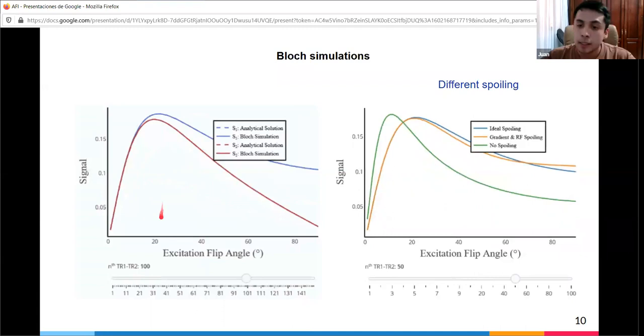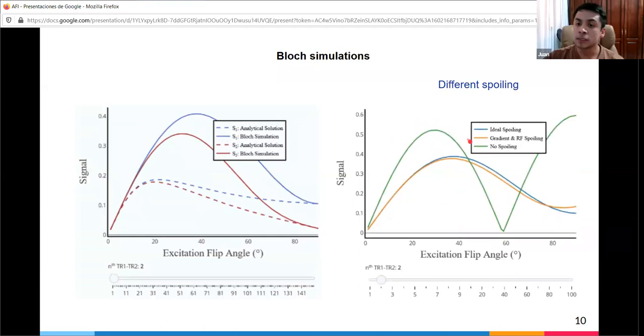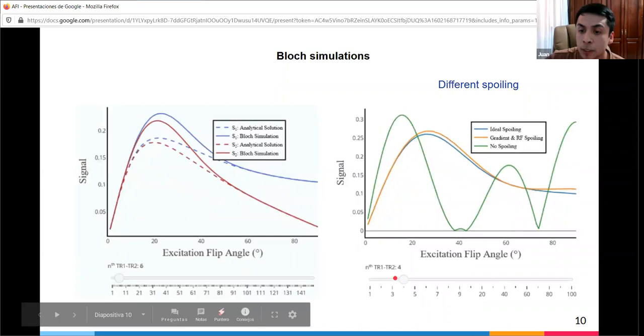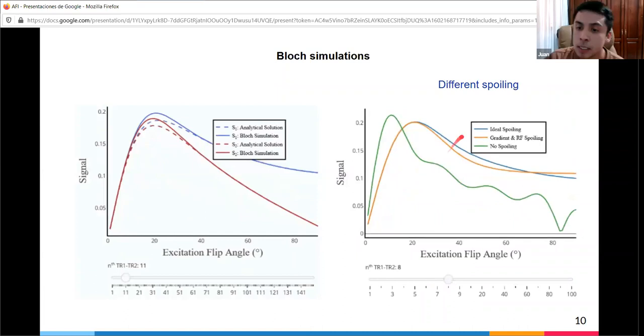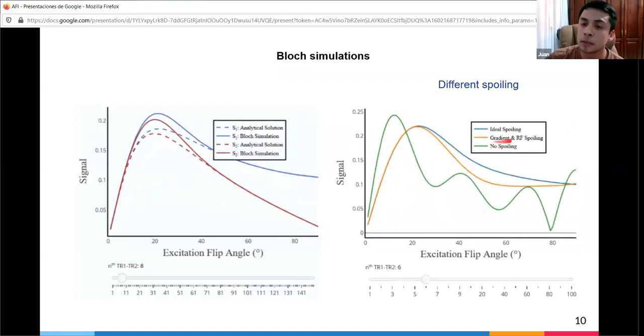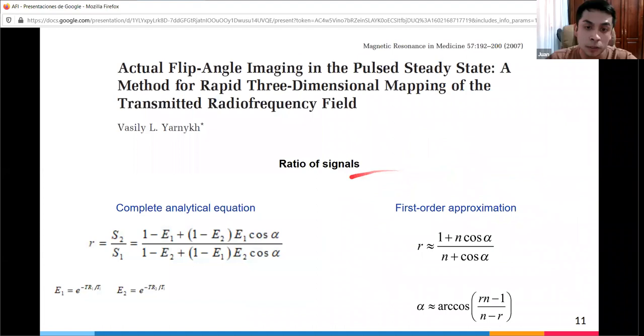Bloch simulations are useful to see the effect of different spoiling. The right curves correspond to signal 1 only. The blue line is the signal ideally spoiled, the green curve is signal with no spoiling. Between these two curves, even after many repetition times, the signals are very different. There are more similarities between the ideal and when spoiling is applied. This also depends on excitation flip angle. All these equations and plots come from a 2007 paper by Vasily L. Yarnykh.